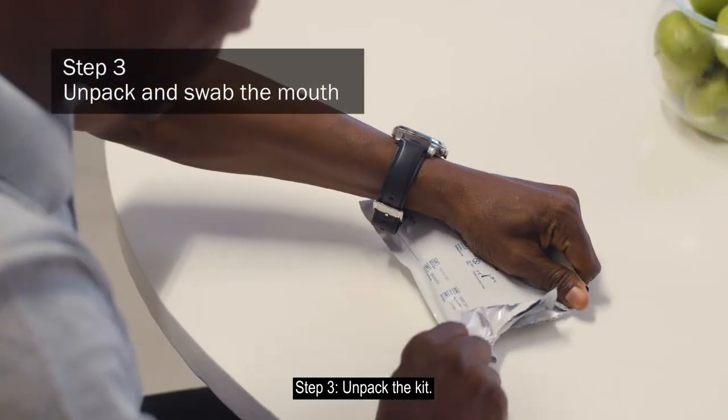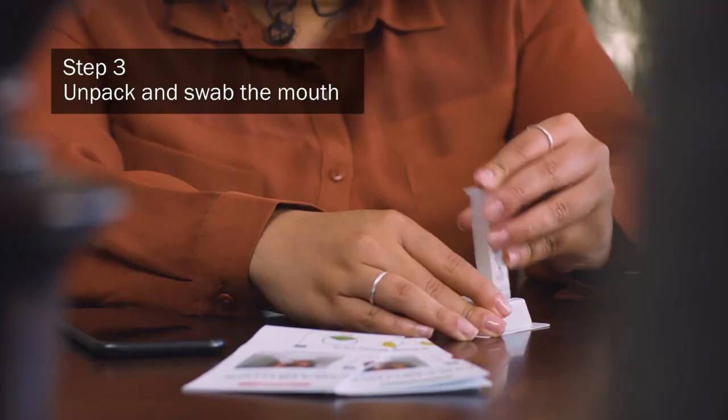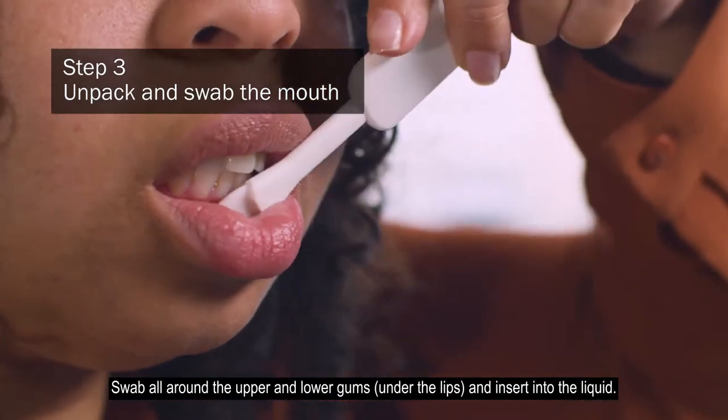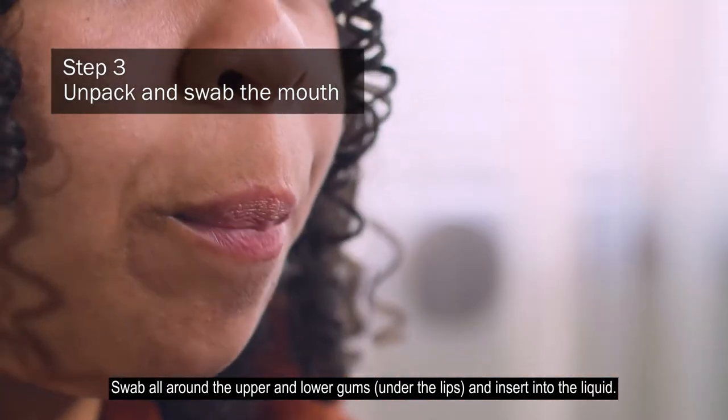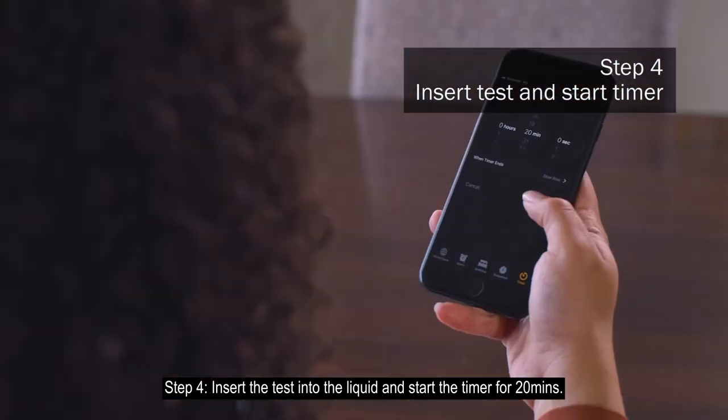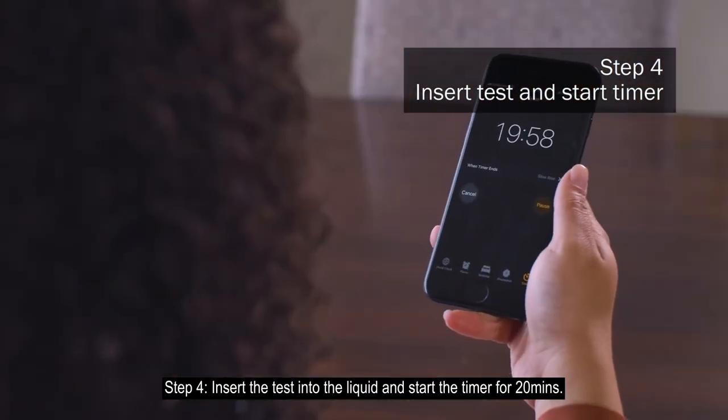Step 3: Unpack the kit. Swab all around the upper and lower gums under the lips, and insert into the liquid. Step 4: Insert the test into the liquid and start the timer for 20 minutes.